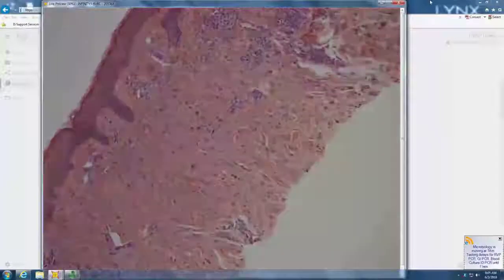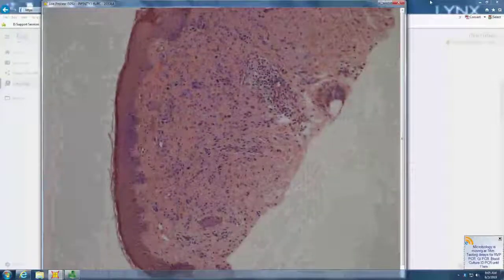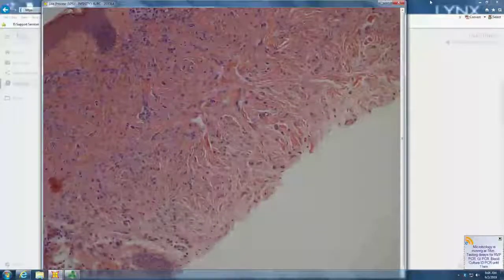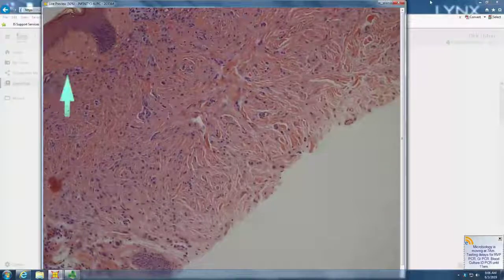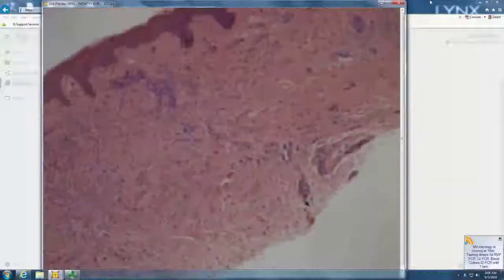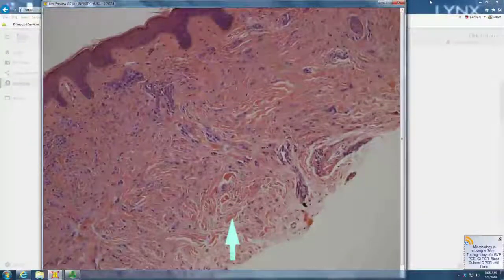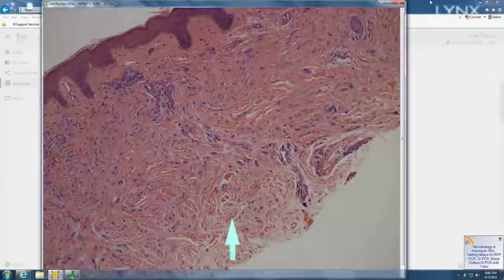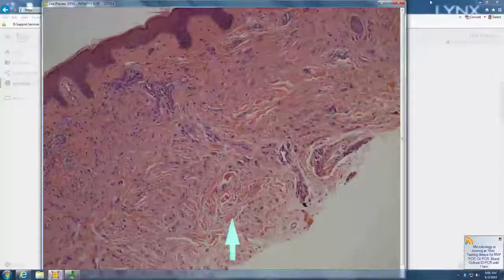Melanoma is a thought. You know, it certainly has ropey collagen. I see one little bit of lymphocytic inflammation, but not a lot of lymphoid aggregates. Do you see anything at the junction? No, not really. And the cells are kind of spindled and epithelioid. So what other kind of nevus can give you ropey collagen and spindle and epithelioid melanocytes? Blue nevus can.